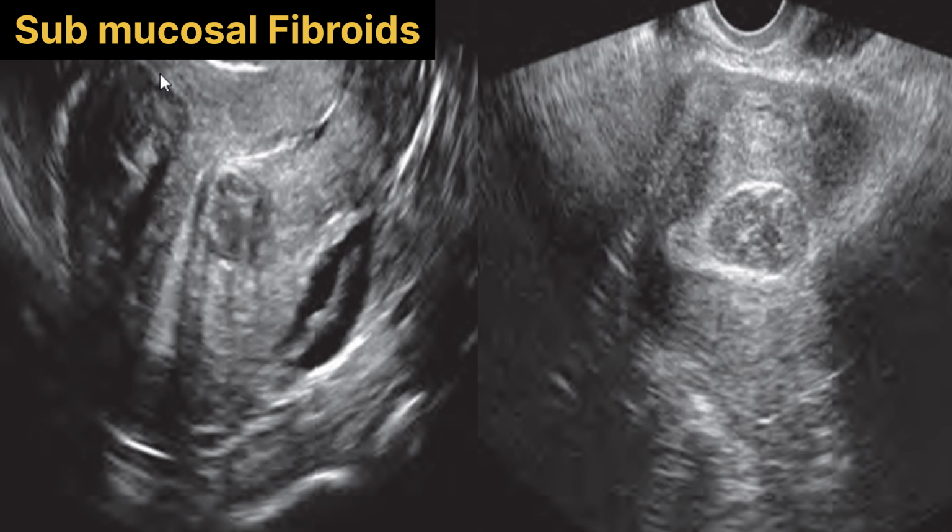And here we can also see another fibroid which is present in the anterior uterine wall, and a small amount of fluid is also seen here in the cul-de-sac. Now this is a transverse transvaginal image of the uterus. This sonogram reveals a small submucosal fibroid which is surrounded by the endometrium of the uterus. As this fibroid is present in the cavity of the endometrium, this is called an intracavitary fibroid.